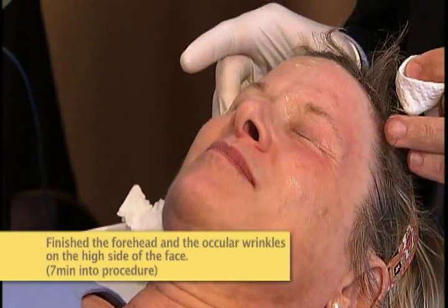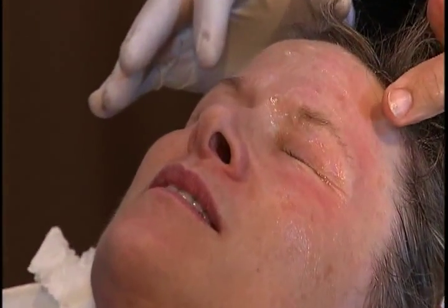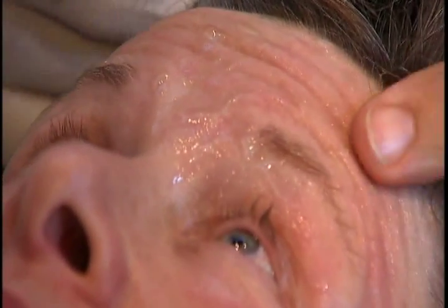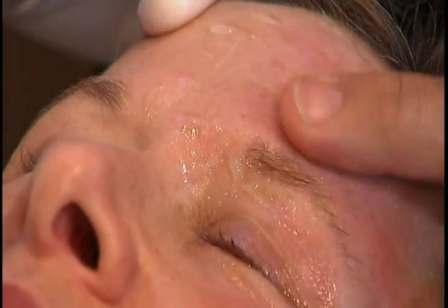Go ahead and raise your brows. See the difference in the depth of the wrinkles raise up? See how this is much softer and stands up higher than this? This is where my thought is that if we Botox these people before and make it so she can't re-wrinkle this for 4 months, I think the results will be better.